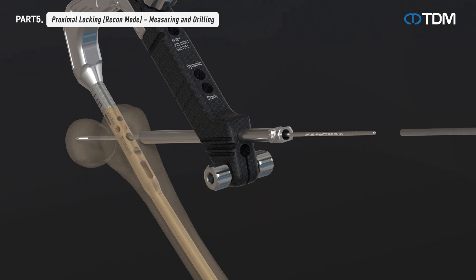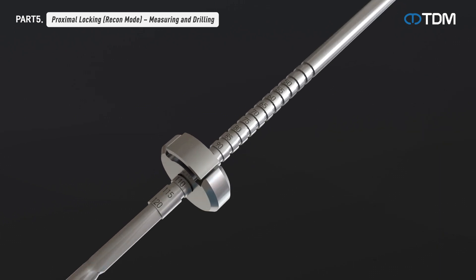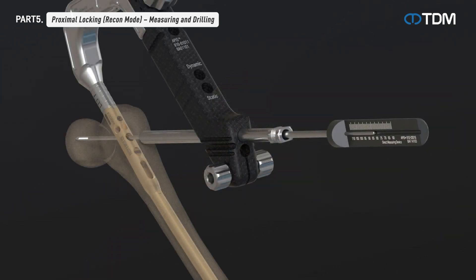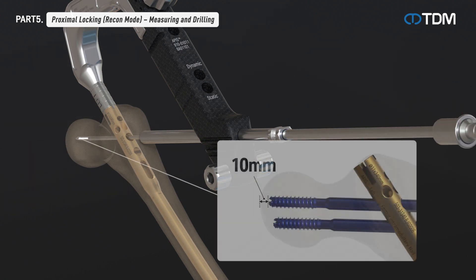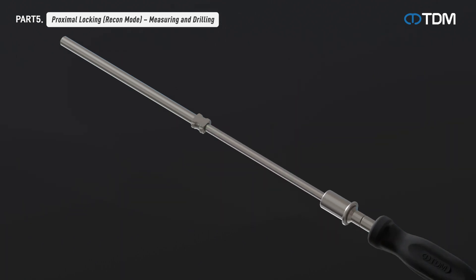Remove the drill sleeve and set the location so that the measured length matches the behind number of the step drill stopper, then drill. Attach the screwdriver to the screw head and insert the screw through the protection sleeve. The cannulated lag screw is inserted along the inserted guide pin, while the solid type lag screw is inserted after removing the guide pin.